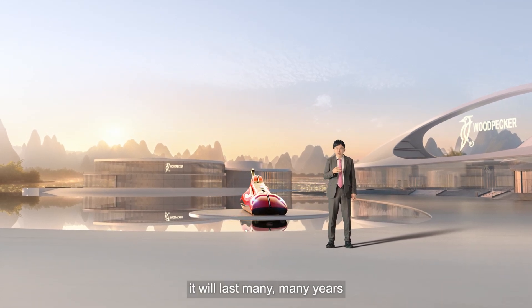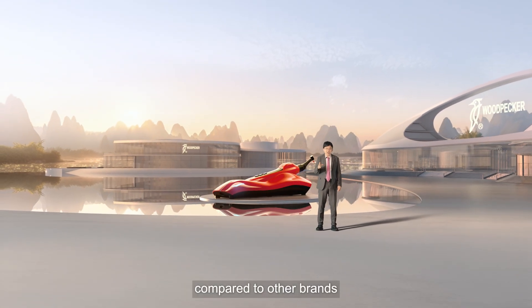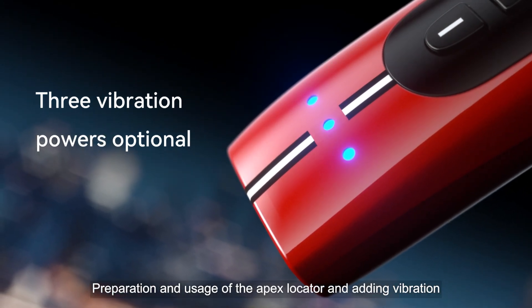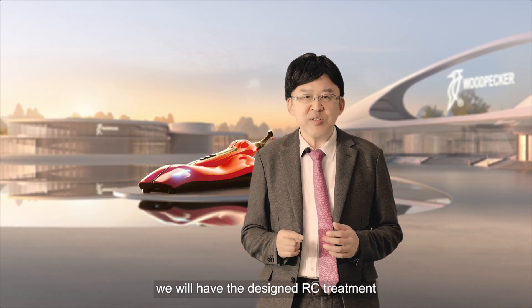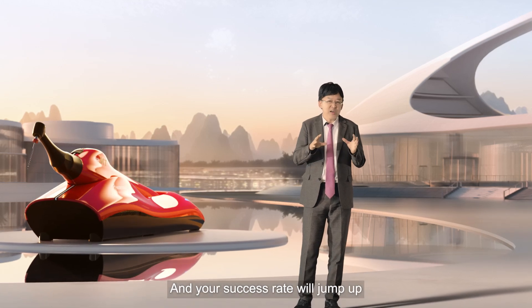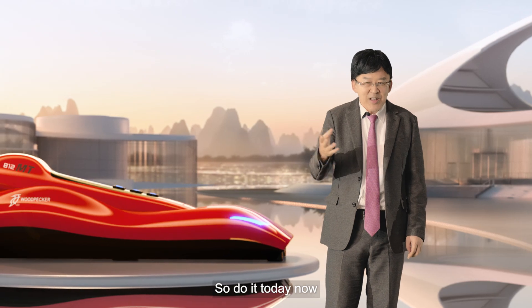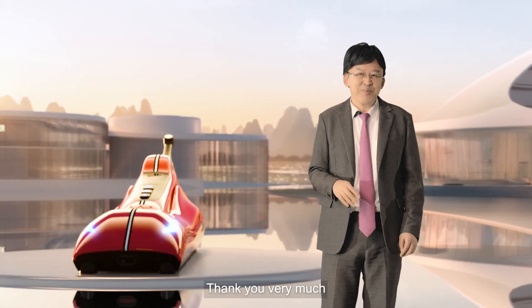It's very good and will last many, many years, and it's not very expensive compared to other brands. There are many features you can use: by activating T-Mode Plus, preparation, apex locator usage, and adding vibration, we will have a well-designed root canal treatment. I want everybody to use the 812 MT — your success rate will jump up to almost 100% if there is no extra-radicular infection. So do it today. Your life will be completely different in a good way. Thank you very much.